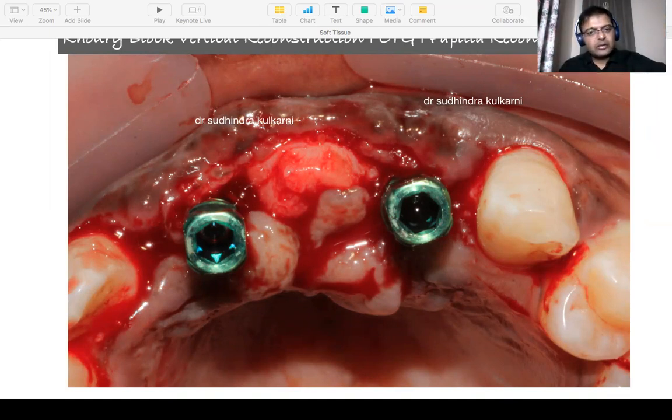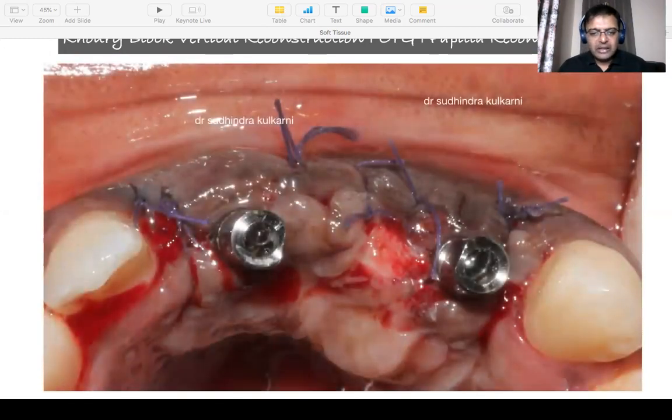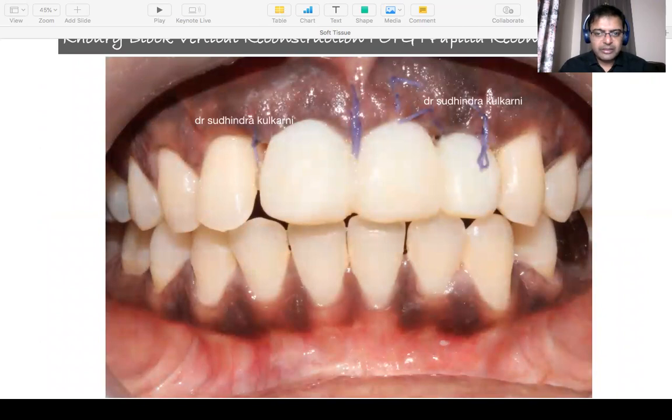It was left there to continue its blood supply and then thinned down so that you could then tie it up and create an incisive papilla. Because the primary stability was excellent on these implants, we temporized it immediately. This is how it looked when she came back for suture removal 10 days down the line.